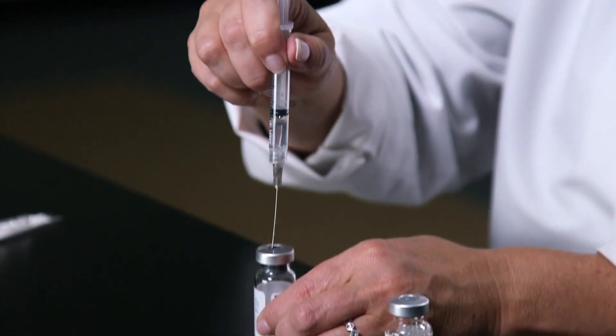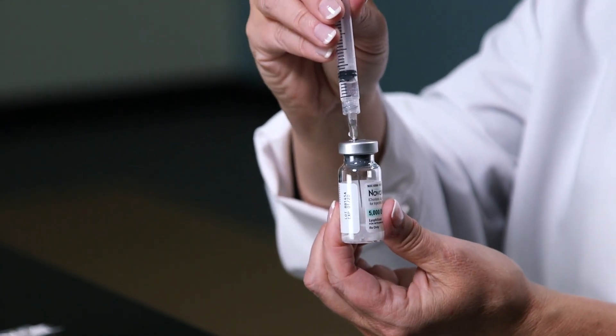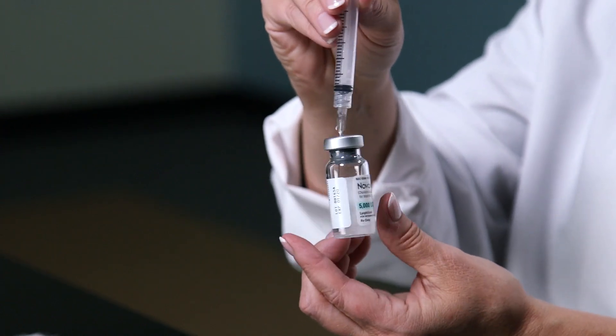You're then going to take that water and inject it into the Novarel powder medication. Inject the water slowly — it will dissolve almost instantly. Give it a little swirl, but don't shake.